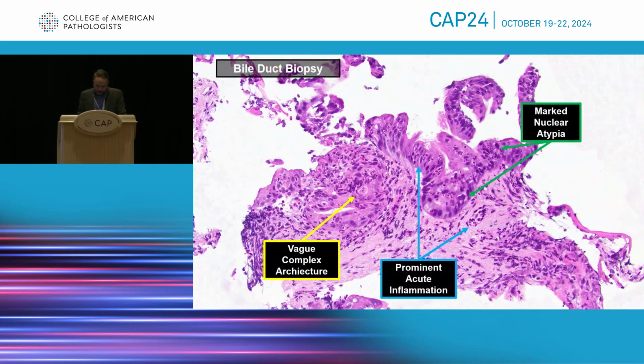Here's another example. In this case, you have a biopsy that's very inflamed. There's a lot of acute inflammation. And certainly you have fragments of mucosa that look like they have dark nuclei, nuclear irregularity and some anisonucleosis. But there's a lot of obscuring with acute inflammation. And a lot of times with these small biopsies, you see inflammation, you want to hold back quite a bit.